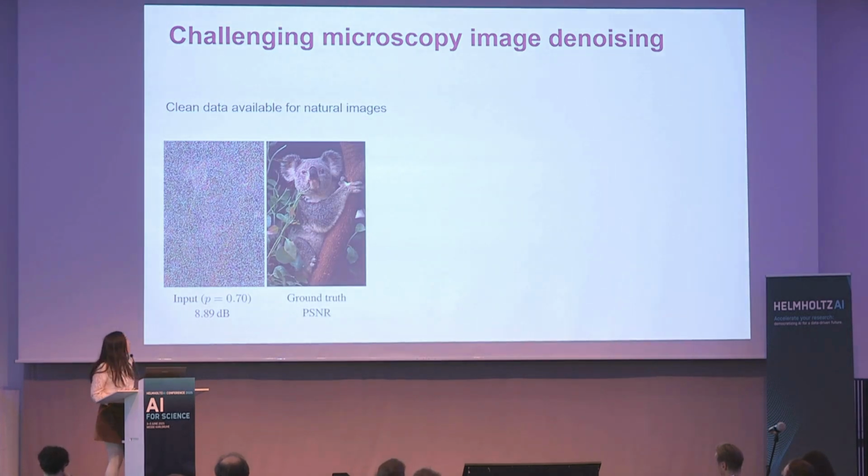For microscope images, one thing always troubles us, which is that there is too much noise. So we have this image denoising problem. This is not a problem for computer vision images. If you have a natural image, you can usually get ground truth with some kind of high-end camera, and then use this ground truth to denoise your bad image into the good image, which is very straightforward. Use a UNet, and it works mostly fine.